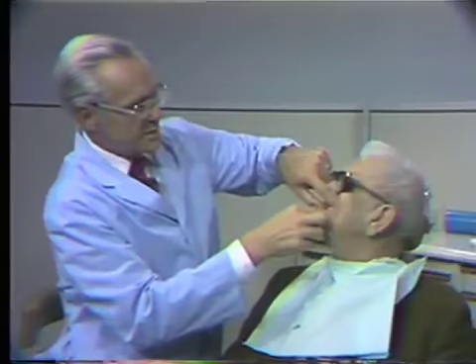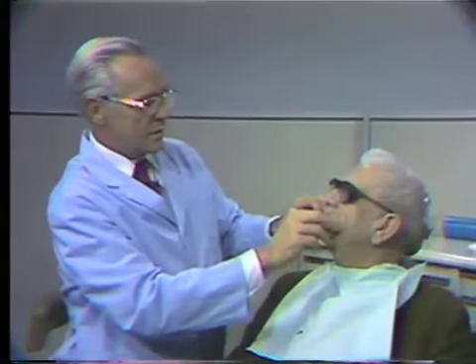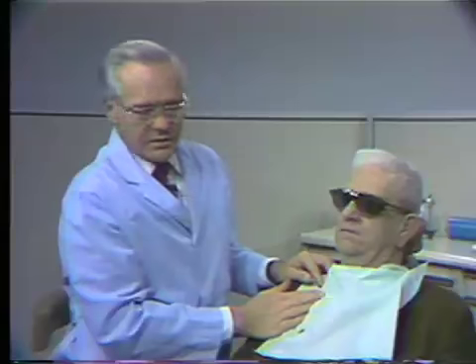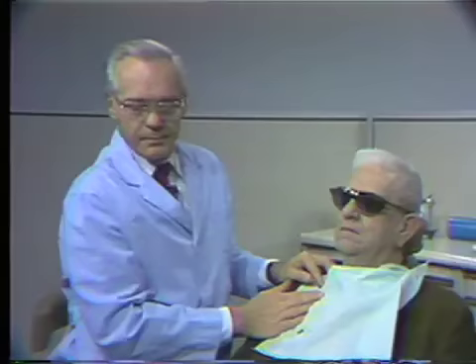This now completes our registration of centric relation. We now will go to our articulator and mount the lower cast to the articulator and proceed to our next step.